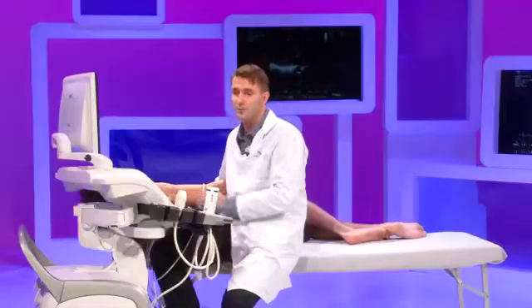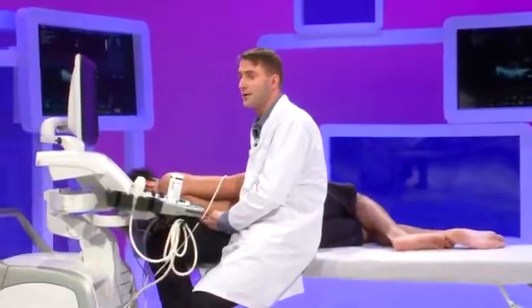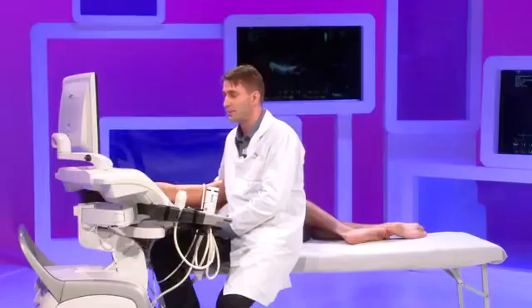Also very important before every echo examination is that the room is darkened to have optimal image contrast, and that the room is silent, because you have to use the audio to optimize your Doppler signals. And as well, every echo examination has to have a good ECG, because the ECG is used for timing, and you cannot do analysis of diastolic function or any other timing of asynchrony without a very good ECG. So this is before starting the examination.